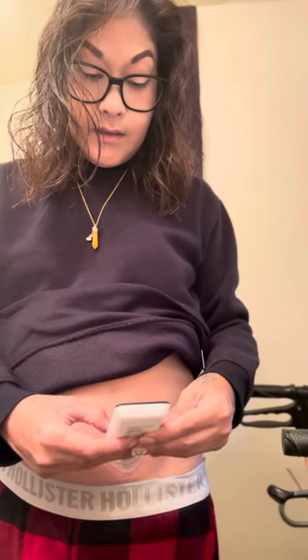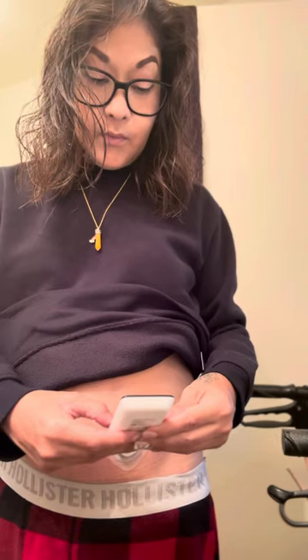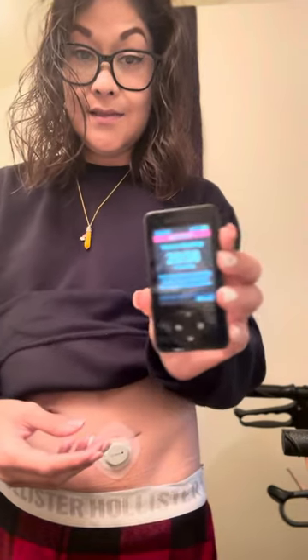I'm going to keep my receiver within three feet of my sensor. It says wait up to 10 minutes. Pairing complete. And the sensor will warm up in 21 minutes, as you can see.